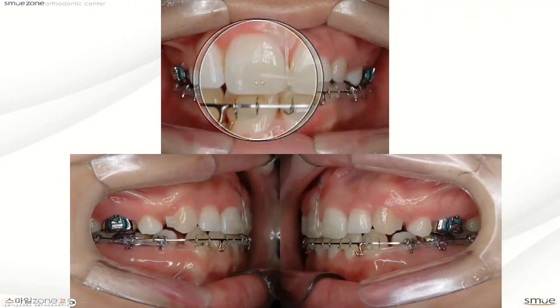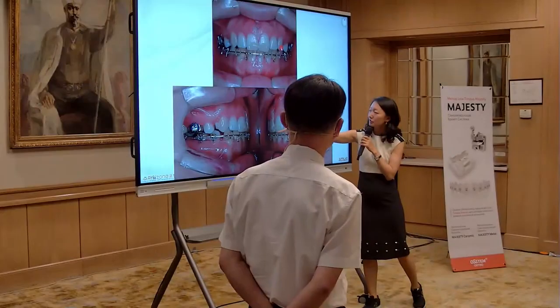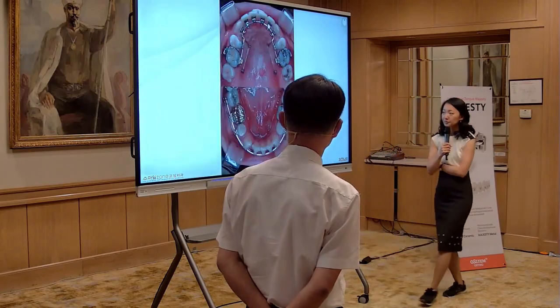Because this is a lingual case also, this one is the fishing string. Fishing string was bonded with the adhesive, and this is the so-called elastic thread. И в данном случае был установлен — I don't understand what fish string. Fish. Леска для удочки. Устанавливается леска для удочки, и она усиливается с помощью композитного материала. И далее интрузия проводится с помощью эластичной нити.